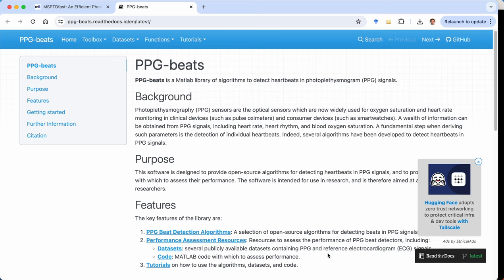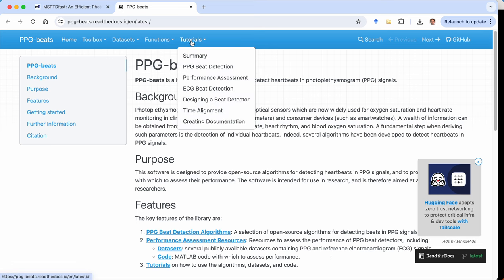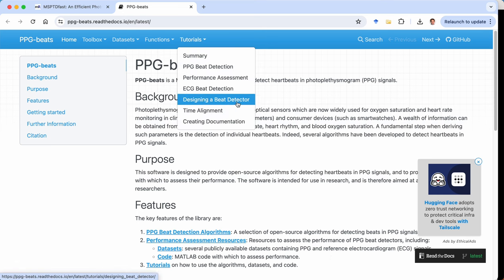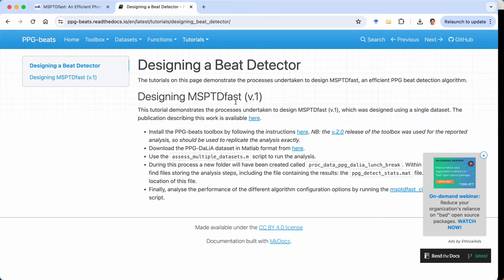This is the website for PPG beats, a MATLAB library of algorithms to detect heartbeats in PPG signals. And we'll be following the designing a beat detector tutorial. So this is the process that we undertook to design MSPTD fast. That's the name of a PPG beat detection algorithm.